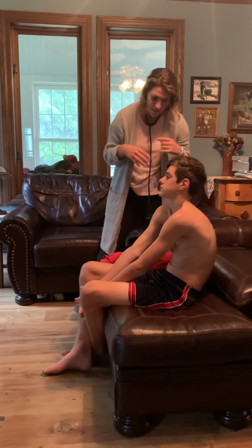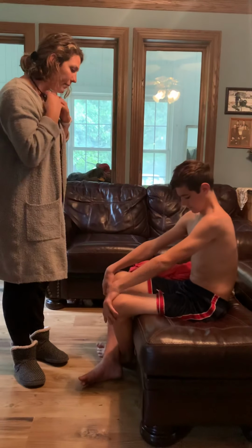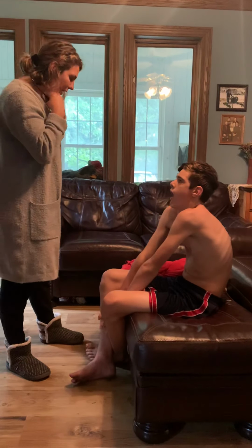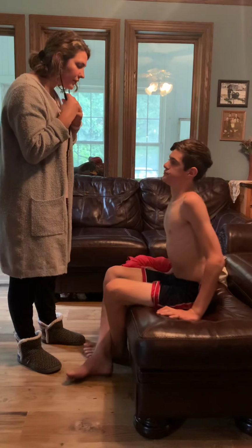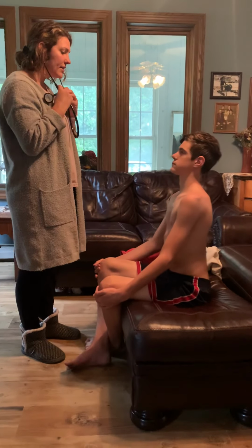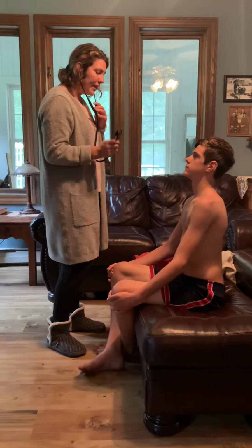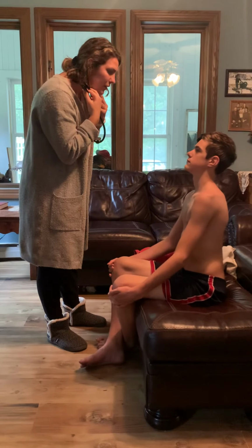So those all sounded nice and normal. Clear lung sounds, equal bilaterally, no abnormal sounds, no wheezing or rales or crackles at all. So I'm going to give your front a listen here, and there's 10 sounds on the front. So again, I'm going to use the diaphragm side, and I'll have you take nice, slow, deep breaths in and out through your mouth, repeating your breaths every time I put my stethoscope down.